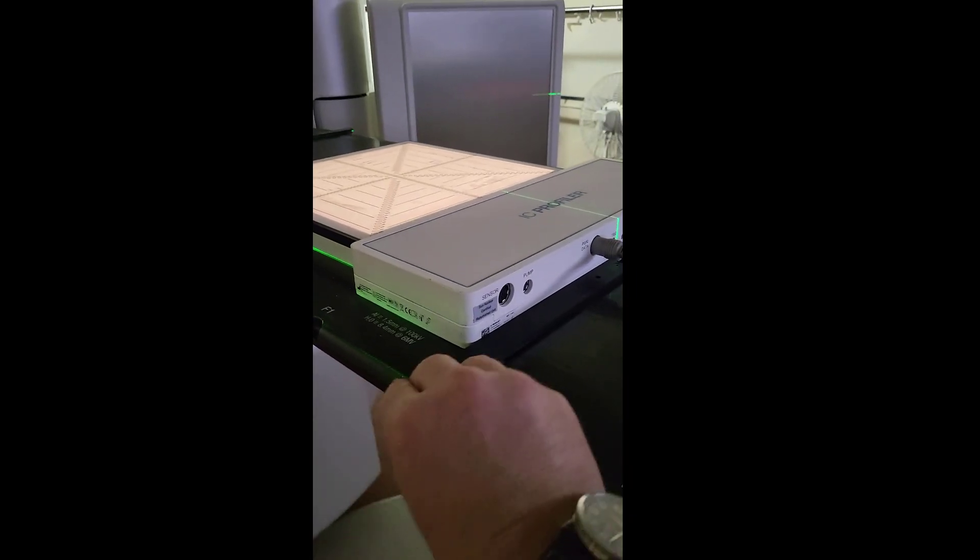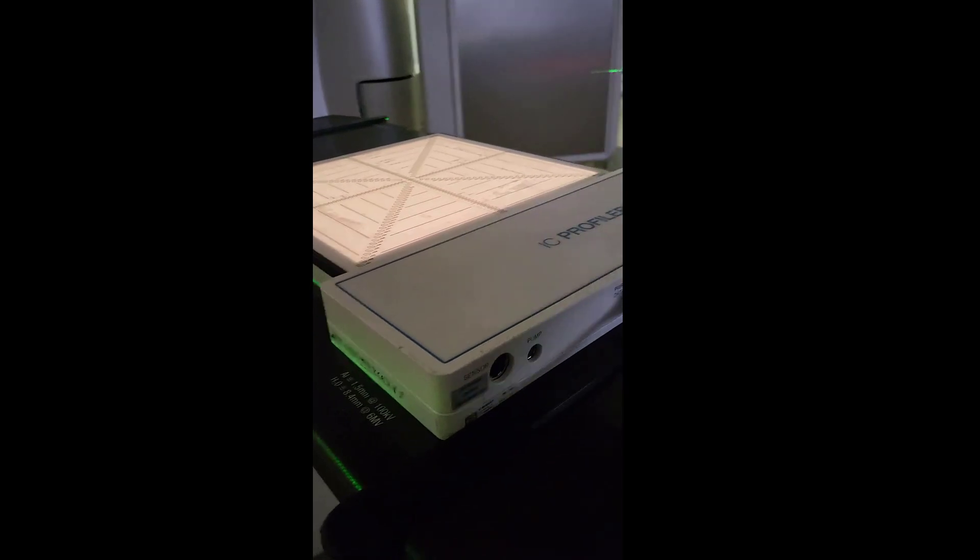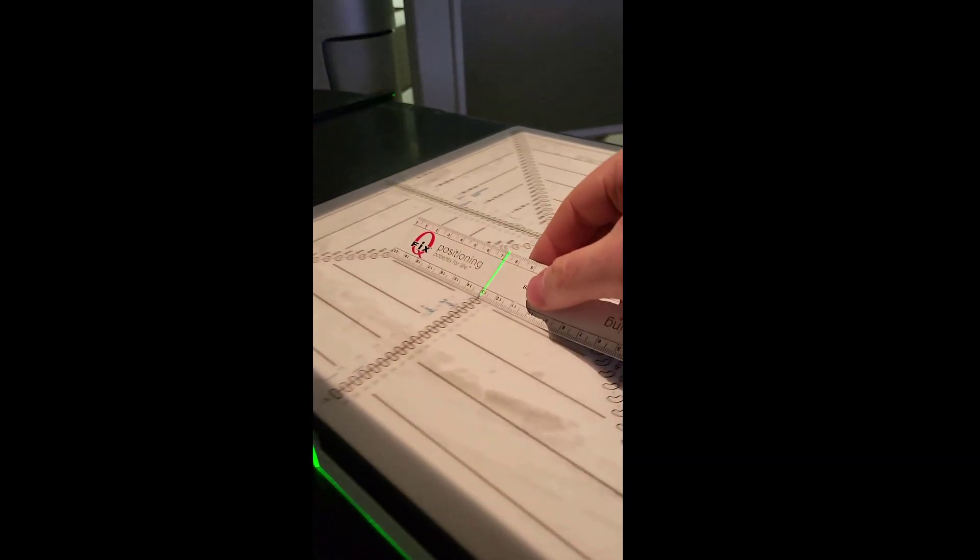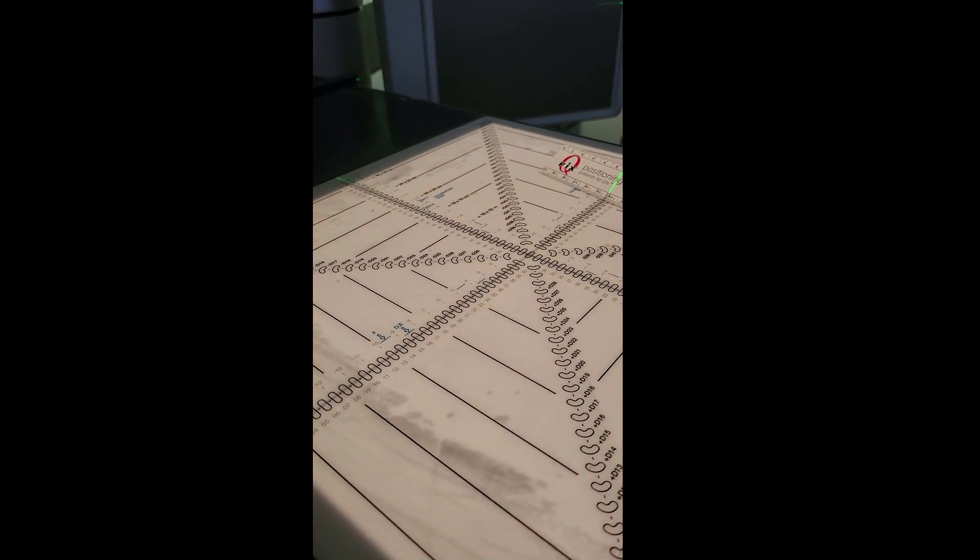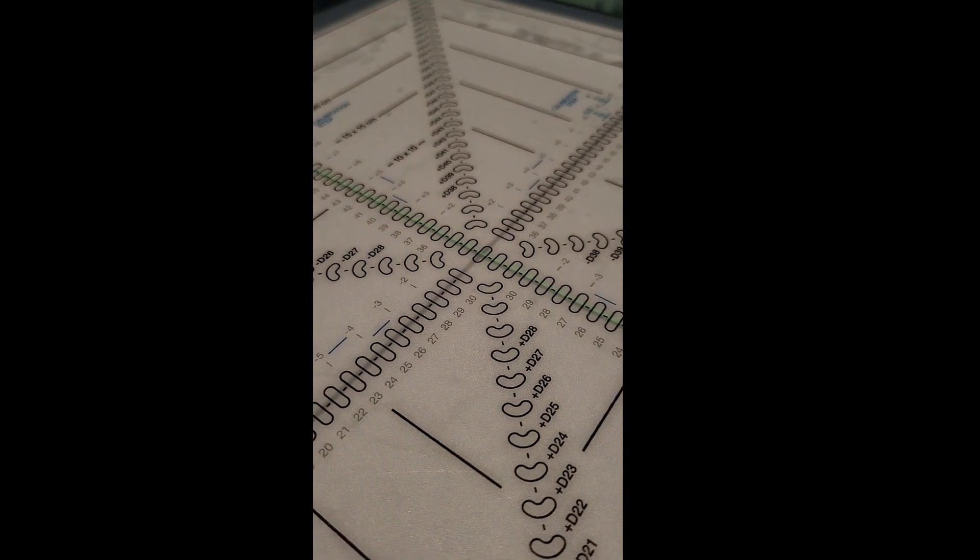Nowadays, we use array devices, ion chamber array devices. And this is probably the more common one, the IC profiler. And each kidney bean shape is an ion chamber.